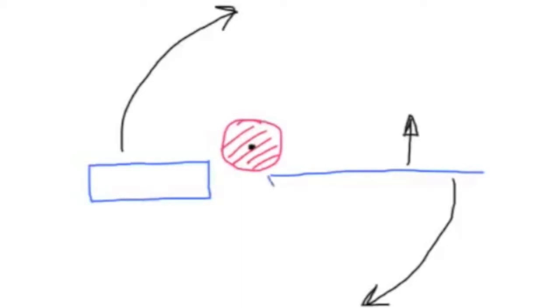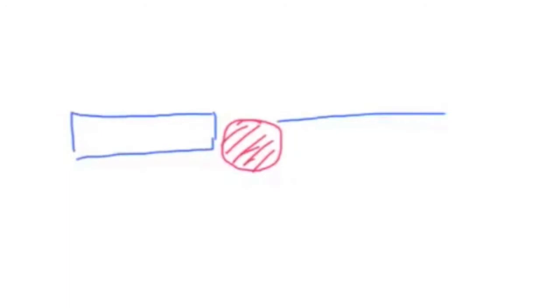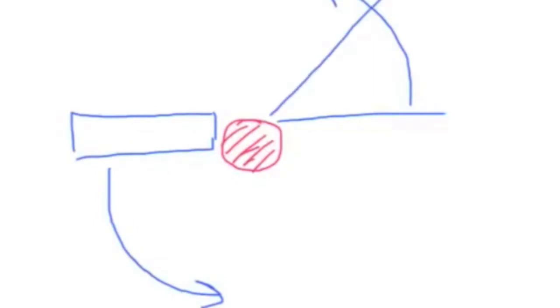And you'll see then that our needle is now straight through the center of the lesion. And this works incredibly well. Now, what about the opposite situation where the needle is on the far side of the lesion rather than the near side of the lesion? Well, we just do the opposite. Instead of rotating clockwise like we did previously, this time we're going to rotate counterclockwise, and again we'll end up with our needle in the center of the lesion like that.